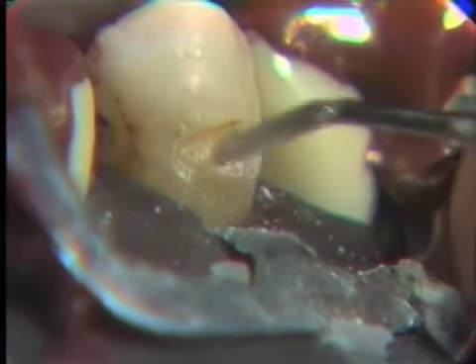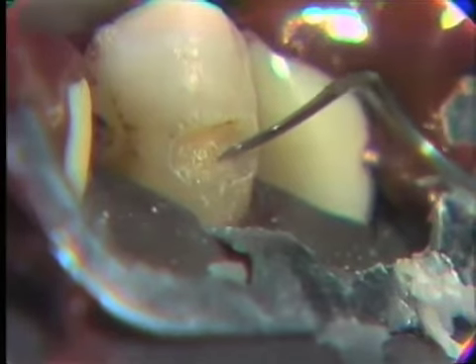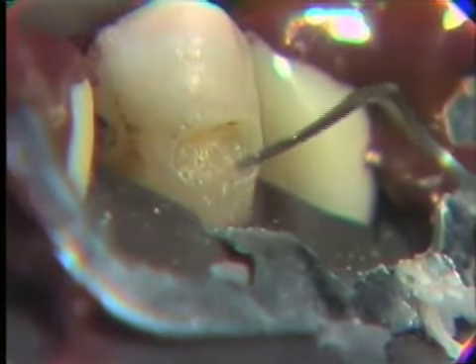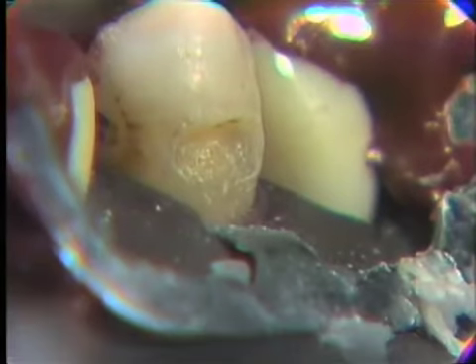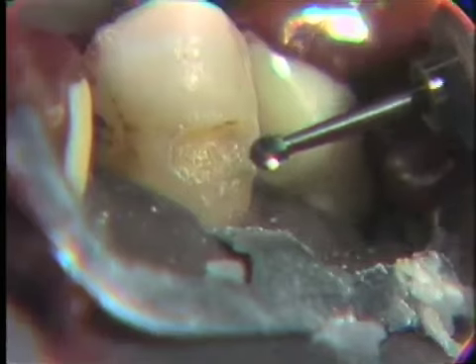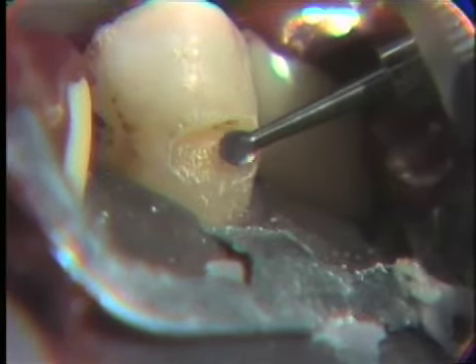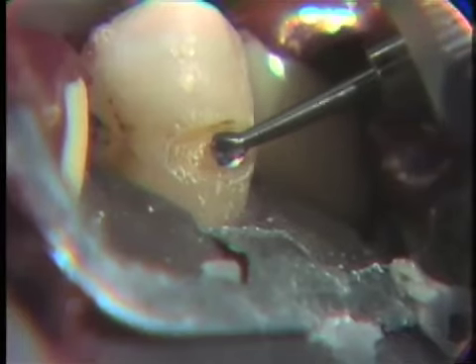We have one spot over in the mesial that appears to be a little bit on the soft side. It is not stained, but right in this particular area we're a little bit soft. That means that we must penetrate to a little deeper dimension here. So we will, at this point, take a number 2 round burr with a low speed handpiece, and we will gently penetrate into this area of soft dentin, right at this point. Just gently stroke.